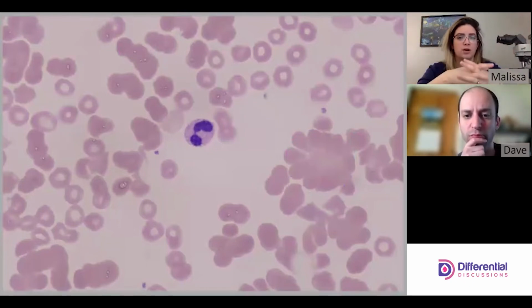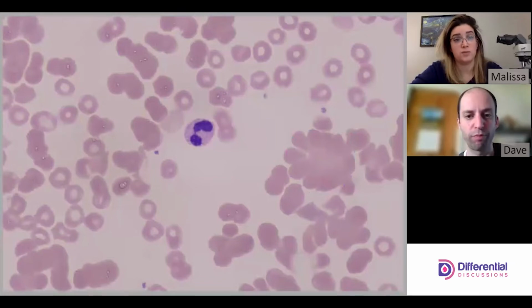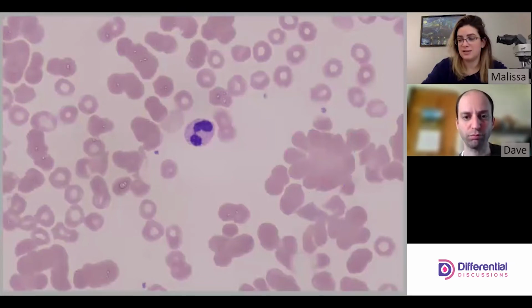The antibodies can react at that temperature if they're really strong. But a lot of them are more cold acting, so it has to actually be colder than 20 to 25. It depends on the patient, the antibody, and the amount and strength of the antibody. That's why sometimes you get something like this slide that I was mentioning earlier.